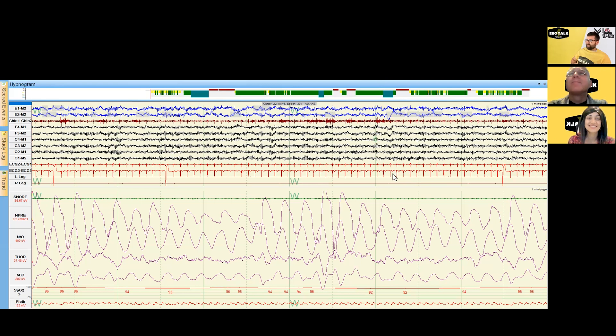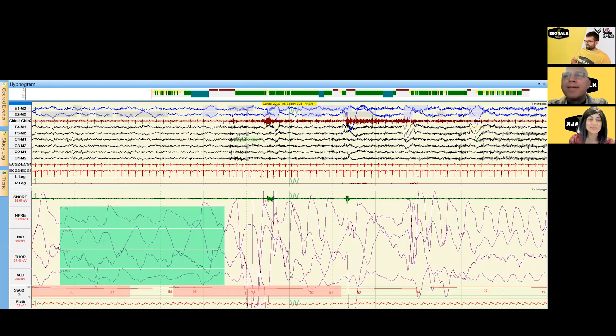That looks just like muscle artifact on the EEG there. You can also see a couple of premature ventricular contractions here, so that's something to keep an eye on as we go through — hopefully not too much coffee too close to the sleep study.